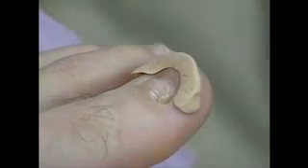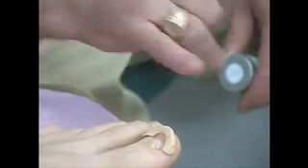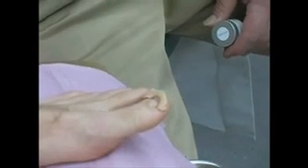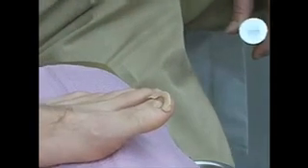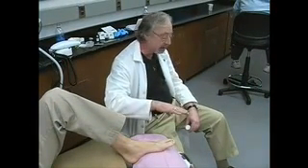Now when you start with the resin, which we're going to do next, I chose natural for this because I want to try to match his other nails, and there wasn't a lot of discoloration to the existing nail plate that's left, so I think this should work well. If there were more discoloration, the opaque would have been better because it'll disguise it a little bit more while you're covering. This is a goof-proof technique because if you build it too large or there's divots, you can grind it, or you can add a second layer to it.